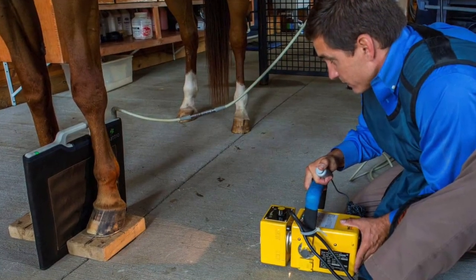With your horses, it might look a little bit like this, where you have someone holding the plate or it's leaned against the horse, and then you have someone with a portable generator taking an image. And then with small animal, you might have something that looks like this, where the dog is laying across the table and might be held up by some sandbags or some towels to get that best image.